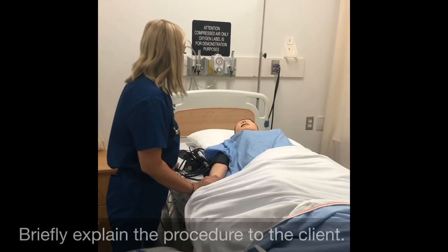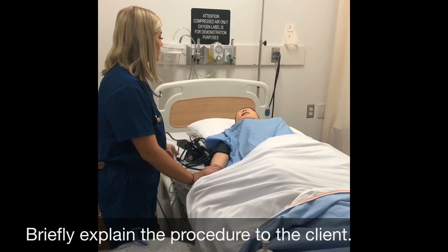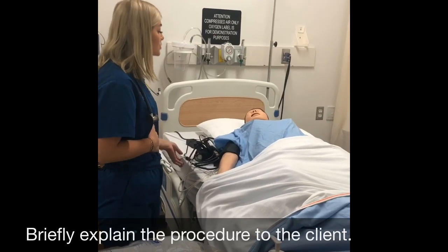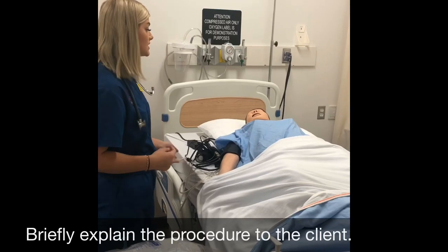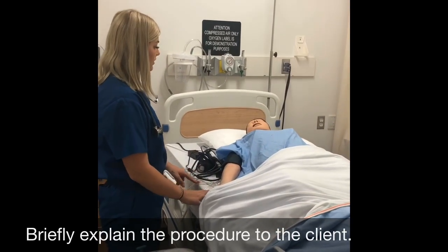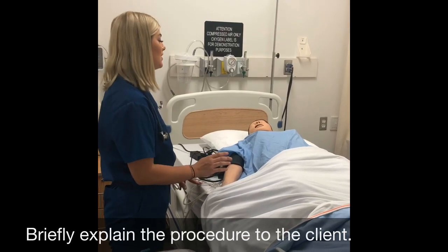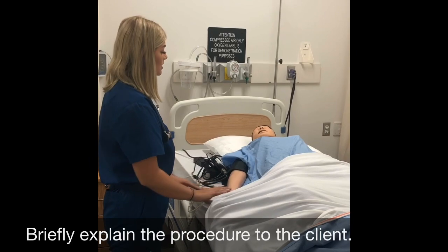Okay, Mr. Mancini, I'm here to insert an indwelling catheter on you today. This is per the doctor's order because you've recently had abdominal surgery and you've been experiencing some lower abdominal pain resulting in difficulty voiding. So I heard the last time you voided was 8 hours ago. Is this true? Okay. And have you ever had an indwelling catheter before?